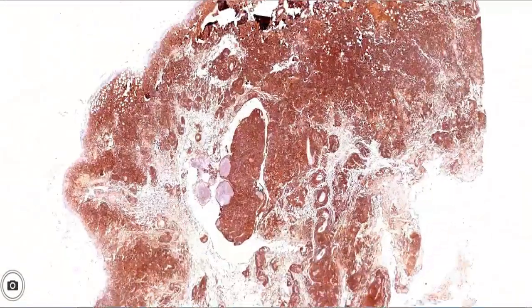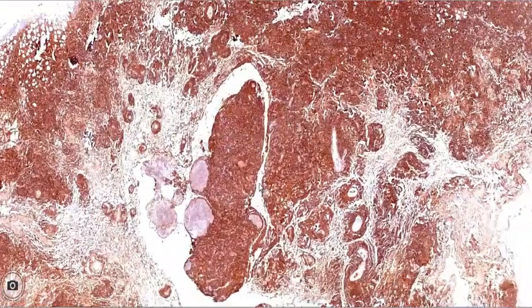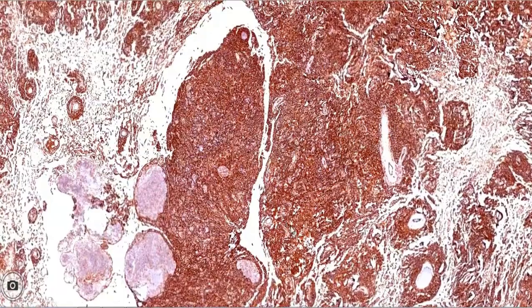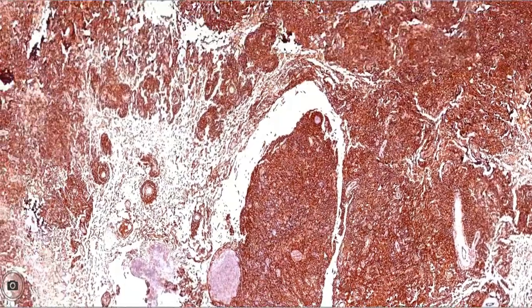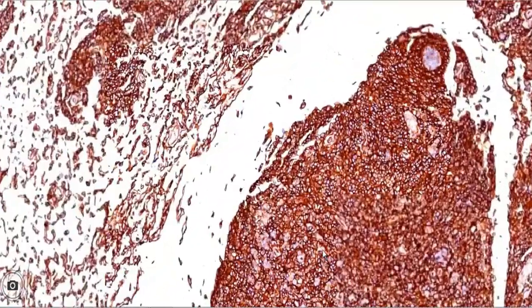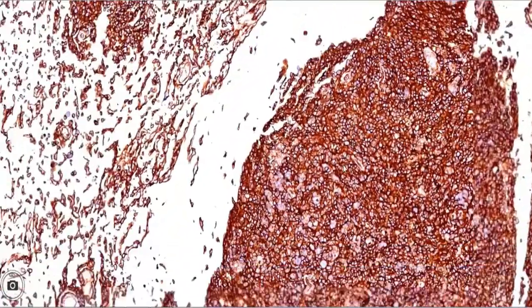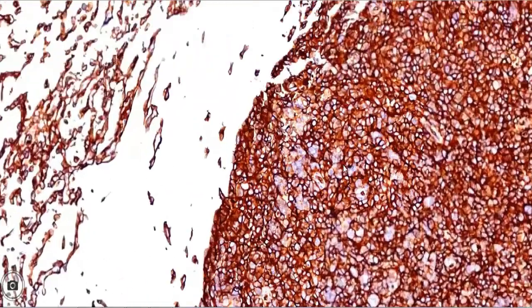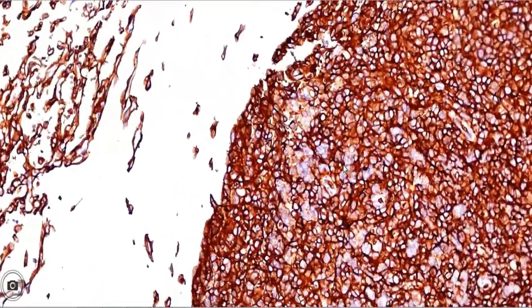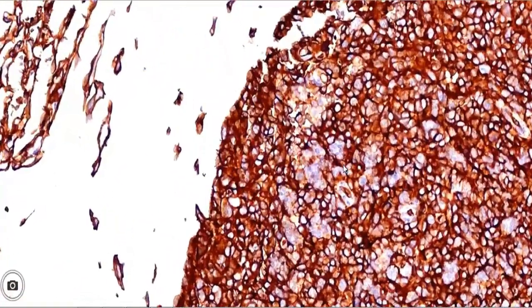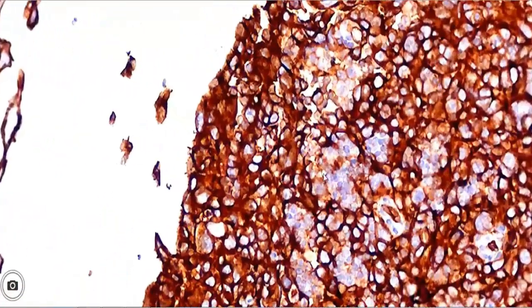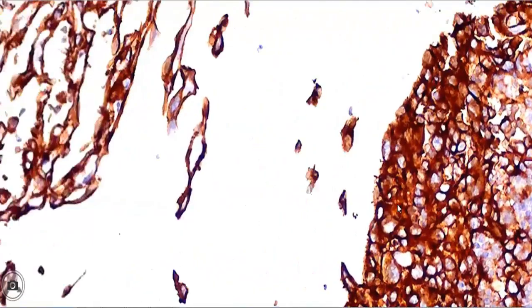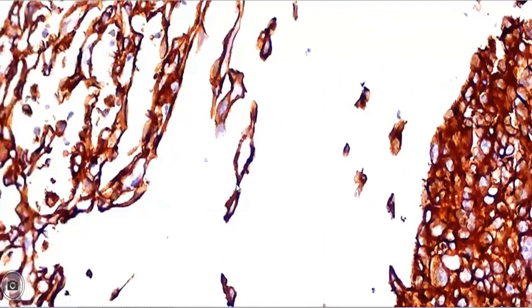Immunohistochemistry for CD31, a vascular marker, shows strong reactivity of tumor cells both in the solid areas as well as in the papillary areas, indicating tumor of vascular origin.